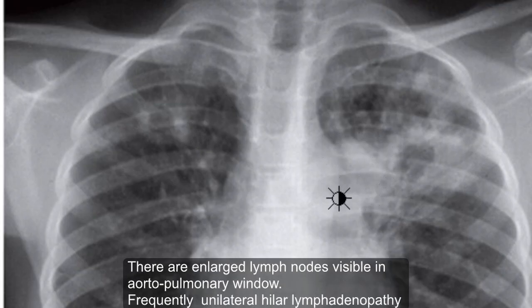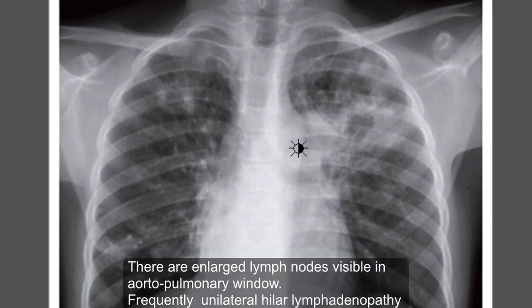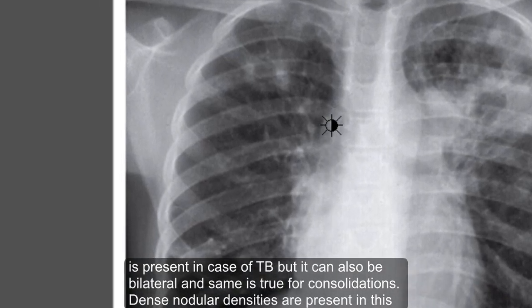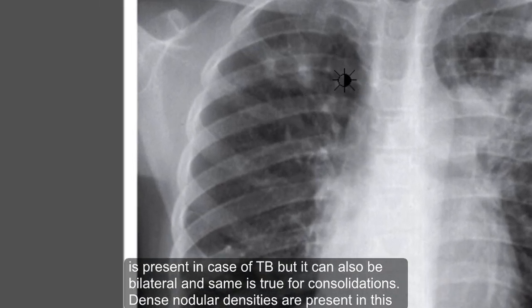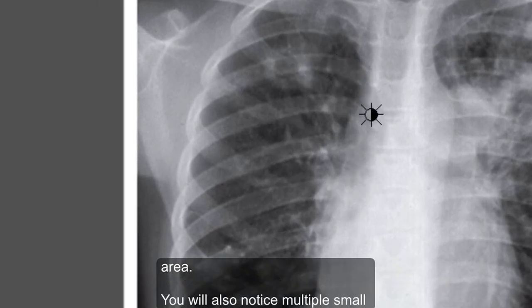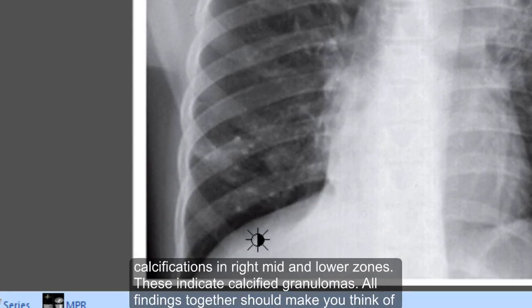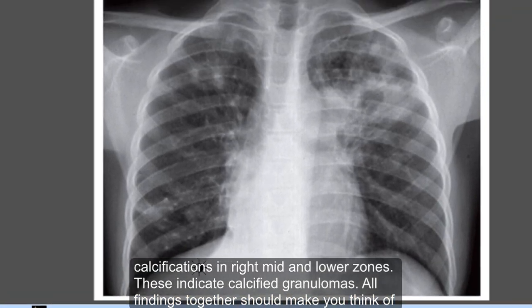There are enlarged lymph nodes visible in the aortopulmonary window. Frequently, unilateral hilar lymphadenopathy is present in TB, but it can also be bilateral — and the same is true for consolidations. Dense nodular densities are present in this area, and you'll also notice multiple small calcifications in the right mid and lower zones, indicating calcified granulomas.